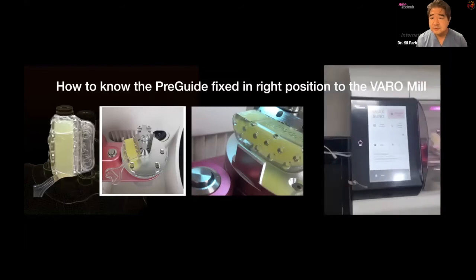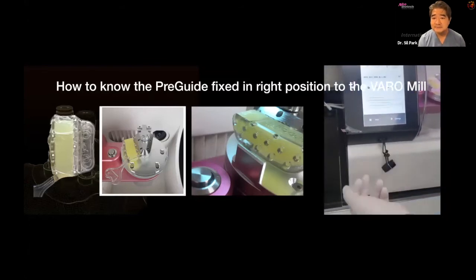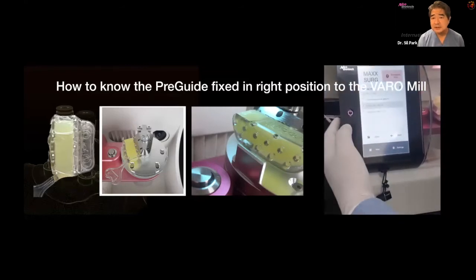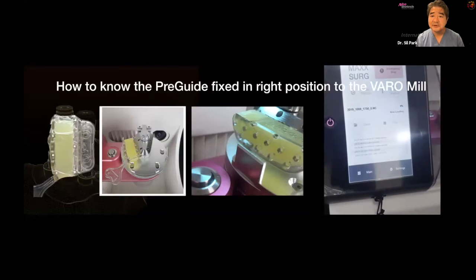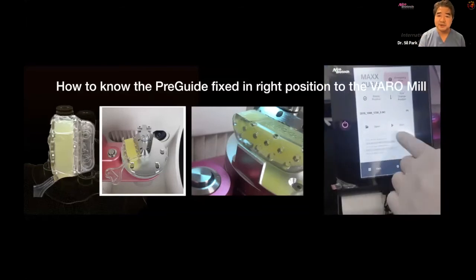So as you can see on the right side, you just put it on the guide itself, and now I am transferring the data into the milling machine itself. It can be connected through Ethernet, or you can use your thumb drive as you can see over here. So now the data is uploading onto the machine.